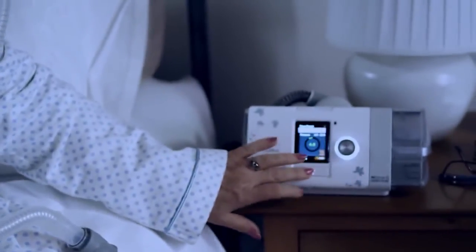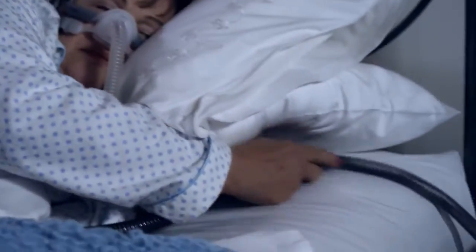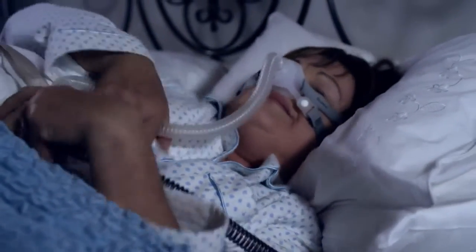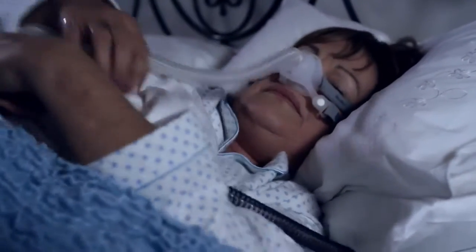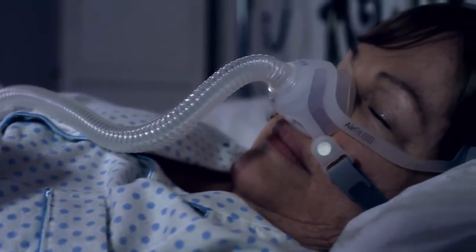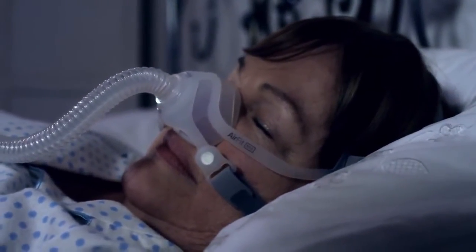I didn't need to put my mask on too tightly, I found out. I noticed that if I put my hand underneath my cheek and adjusted the pillow, I was fine. I was comfortable. And that's when I noticed my sleep started to really improve.